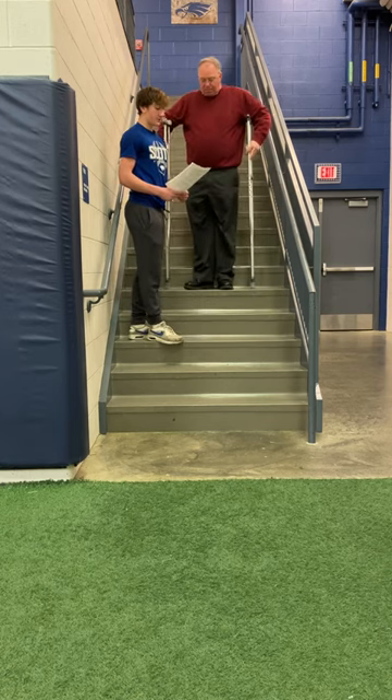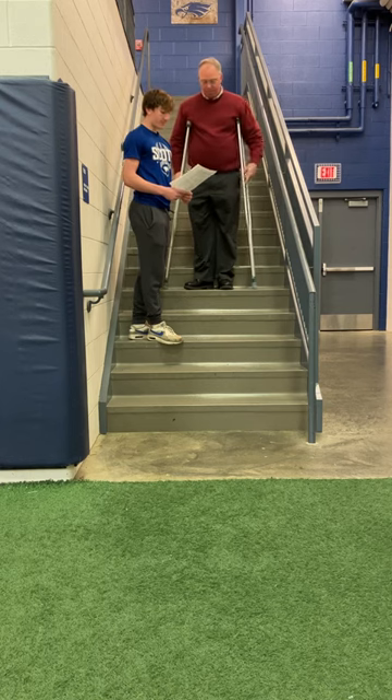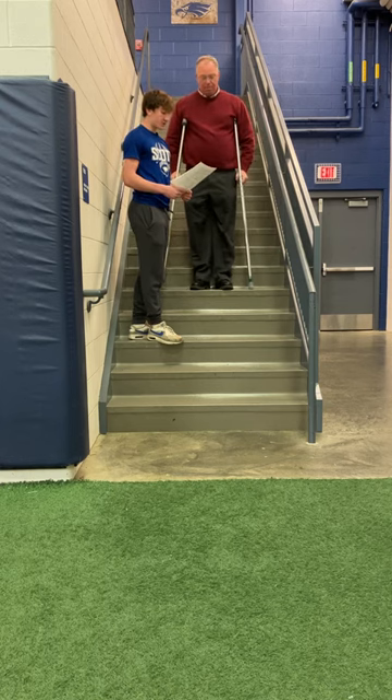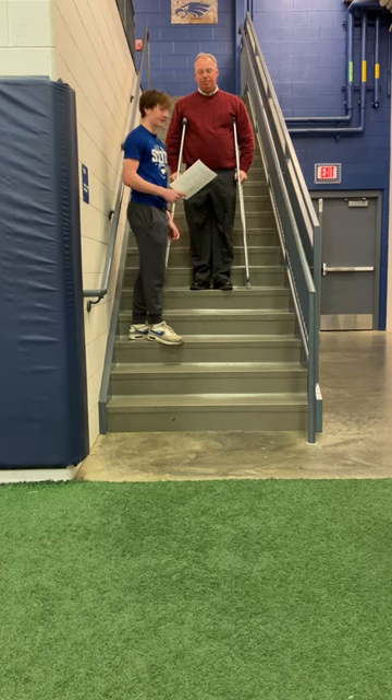Now for walking down the stairs, the rule of thumb is bad foot, good foot. The athlete should move close to the edge of the stair, weight is placed on the unaffected foot, and the athlete moves the crutches and affected foot down to the stair. The weight is then shifted to the crutches and the unaffected foot is moved to the next stair. This process is continued down the stairs.